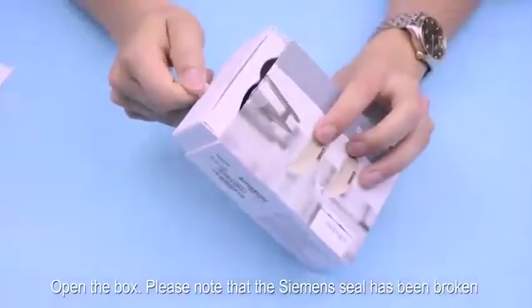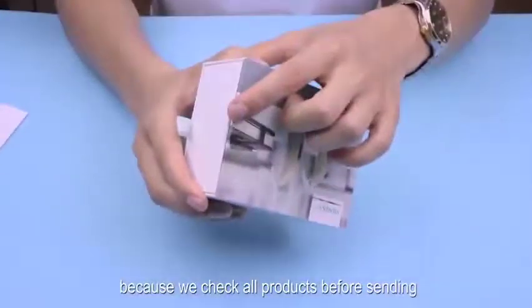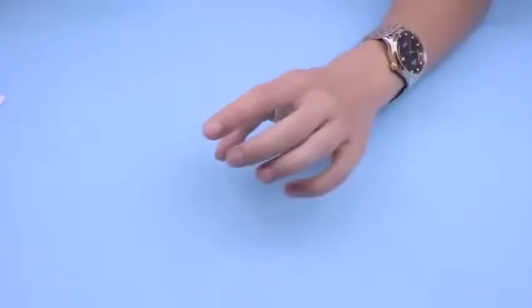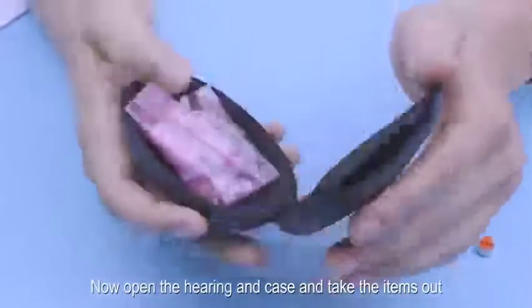Open the box. Please note that the Siemens seal has been broken because we check all products before sending. Now open the hearing aid case and take the items out.